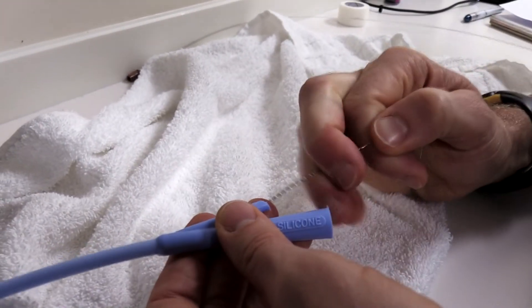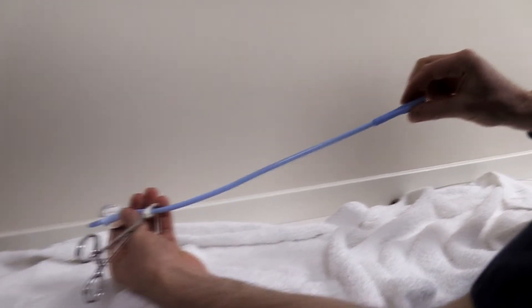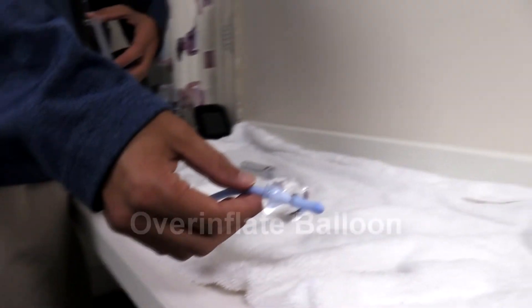We're at least three-quarters of the way in. We'll make the assumption that that didn't drain, that didn't work either. So the other option is to go ahead and over-inflate the balloon and see if you can pop it.